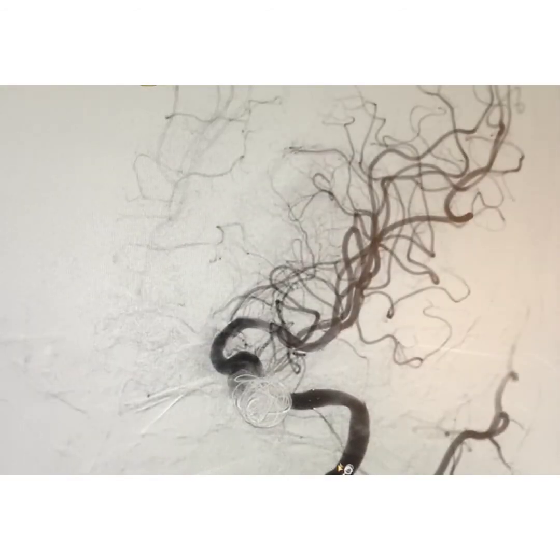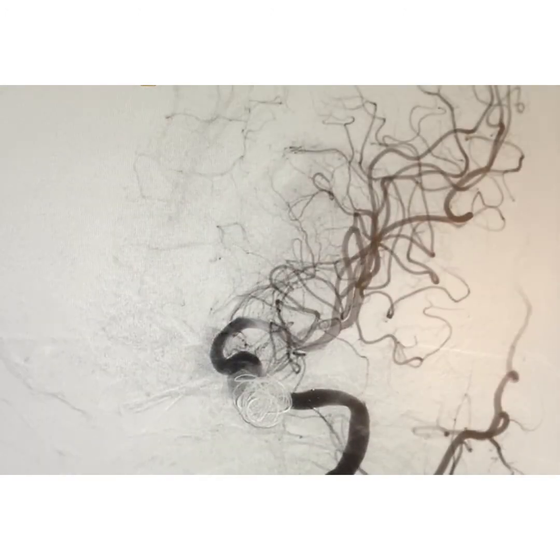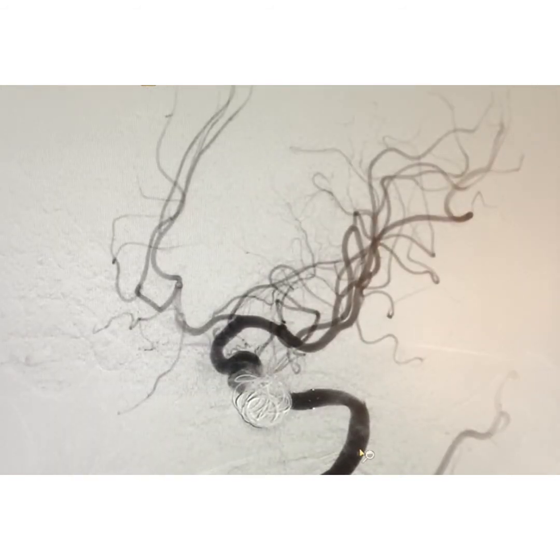So this is the final run of the internal carotid artery, which is showing that there is a very good treatment of this large left ICA cavernous aneurysm, and this is the final picture where you can see that the aneurysm is almost gone, the flow diverter in place, and the blood flow into the ICA and the MCA and the ACA are perfectly fine, and this is a very good result as far as treatment of this large cavernous ICA aneurysm is concerned with flow diverter assisted coiling.